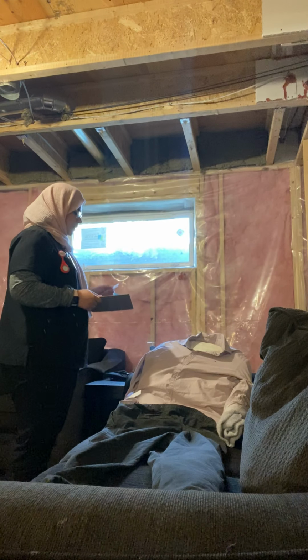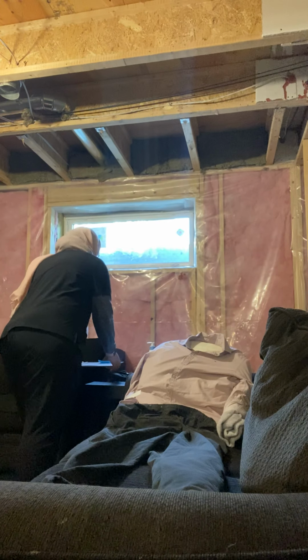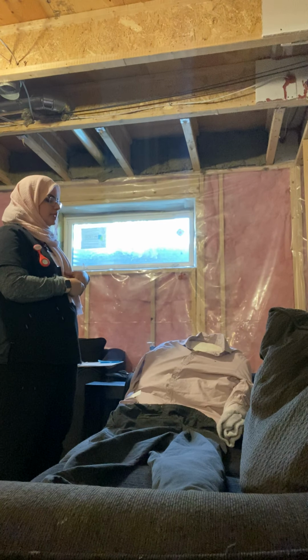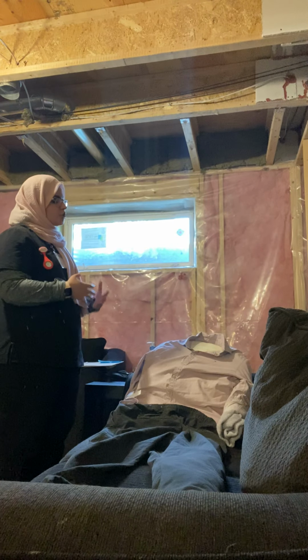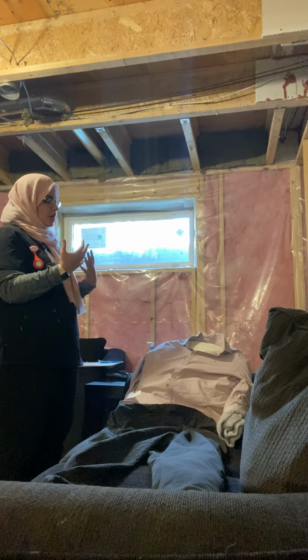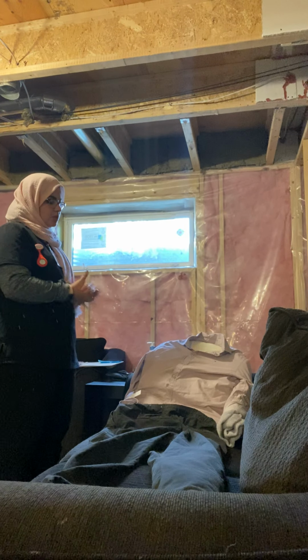I'm just going to start by explaining to you that I'm going to take a set of vital signs. A set of vital signs, Mr. Tom, actually means that I'm going to basically see how overall you're doing. I'm going to take your heart rate, your blood pressure, respirations, SpO2, which is how much oxygen you have in your blood right now. Is that okay with you? Is it okay for me to do it this time?